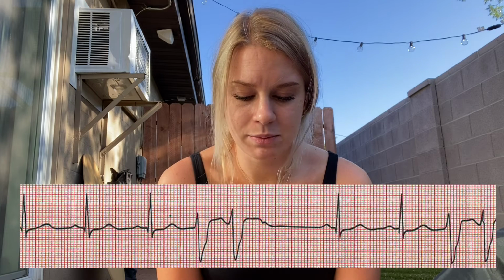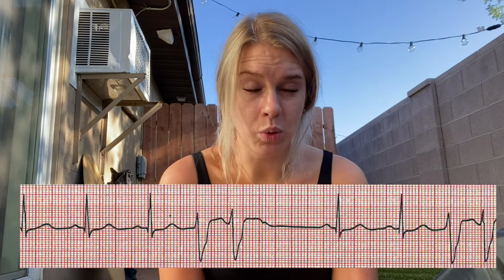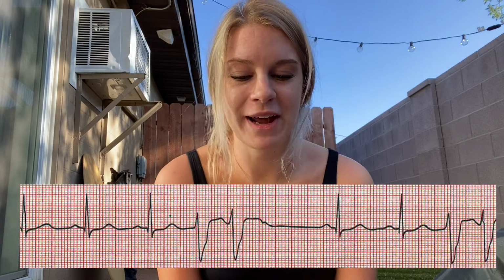Okay, let's go over PVCs, premature ventricular contractions. It is related to ectopy. And ectopy is caused by low oxygen, fluid and electrolyte imbalance, and stretch too. Defining characteristics: the QRS is going to be greater than 0.12. It's going to be wide and bizarre with notches and T waves in the opposite direction. A ventricular ectopic beat is caused by low oxygen on a ventricular cell, especially a left ventricular cell, and it has to jump in early. Physical manifestations of PVCs are a fluttering heartbeat, pounding, and increased awareness of your heartbeat.